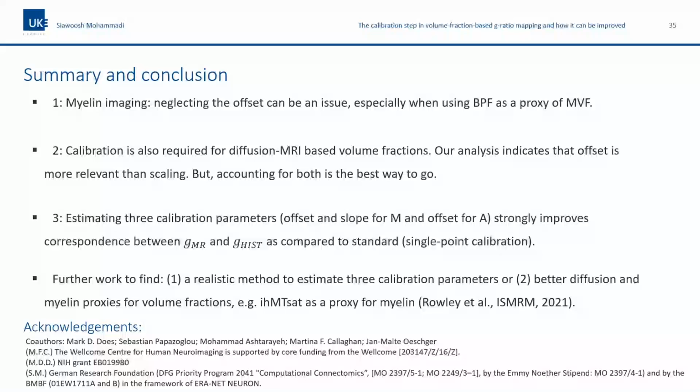Myelin water imaging is at the state where we can have quite robust values, and it might be slightly more specific than T1 mapping. But if you want sensitivity, then just use maybe T1 mapping or MT. The most simple measures will give you the highest sensitivity. They might not be very specific, but if it's just sensitivity to a myelin change that you want.